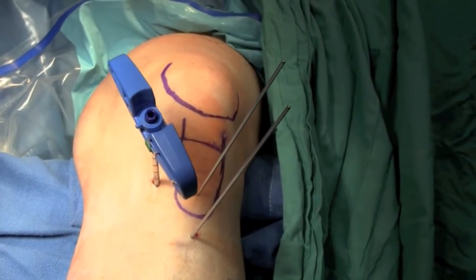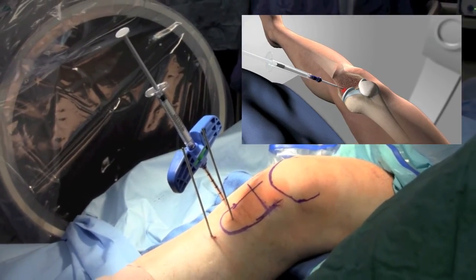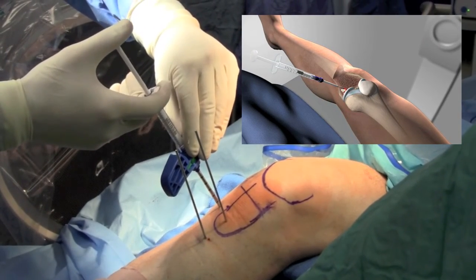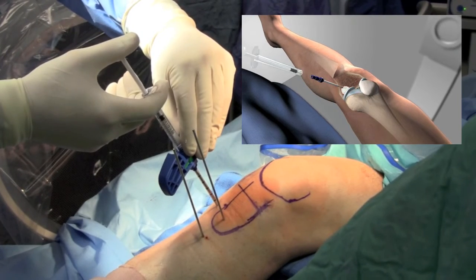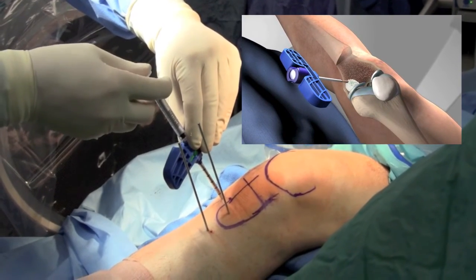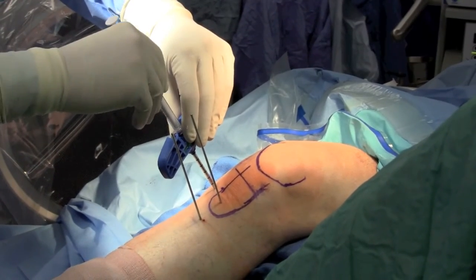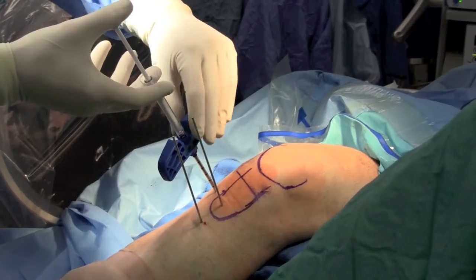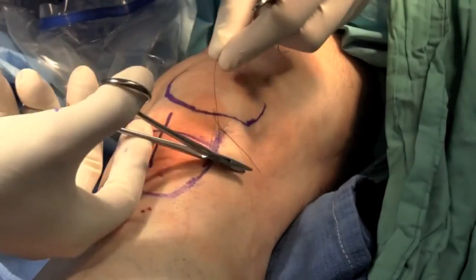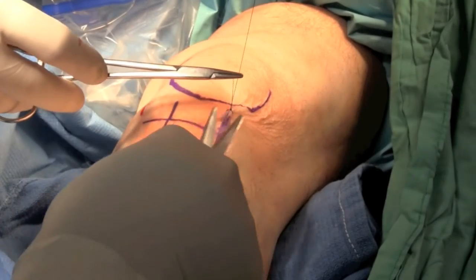You can see the small incisions used for this procedure and the three-dimensional orientation of where we placed the cannula. Once we're very happy with our position, the calcium phosphate substance is injected into the knee. As seen in the animation going into place in the bone, several cc's of calcium phosphate cement are used, and then the fairly small incisions are closed up, and the post-operative rehabilitation begins.